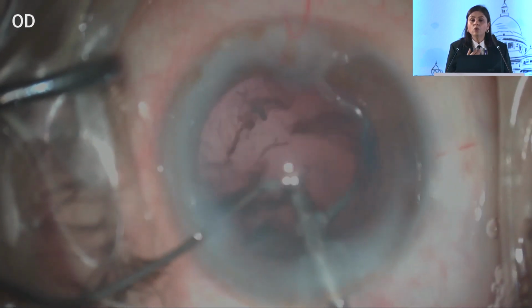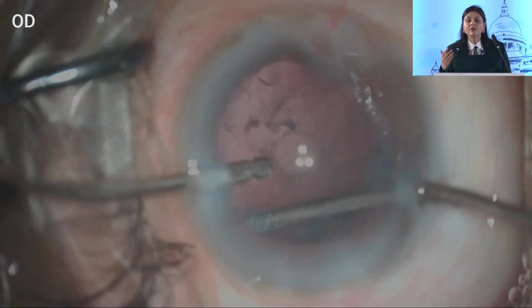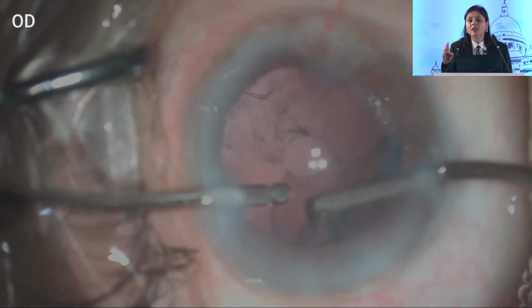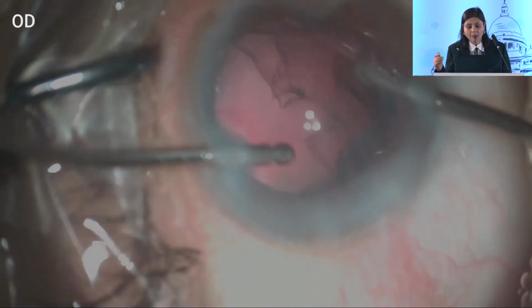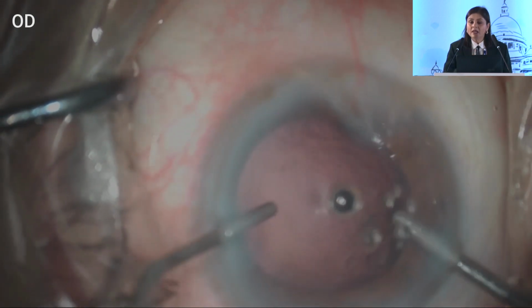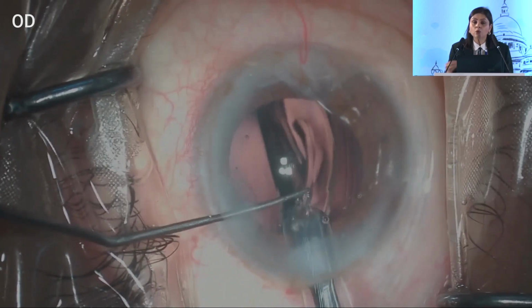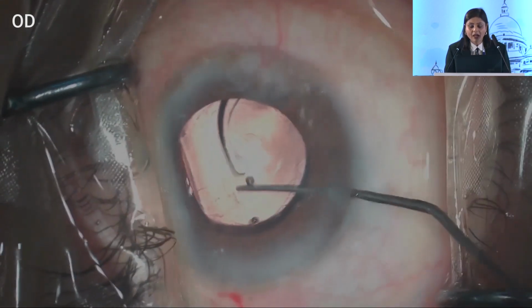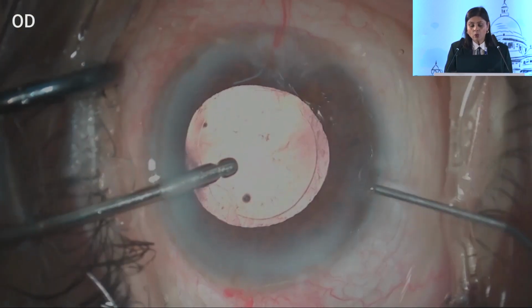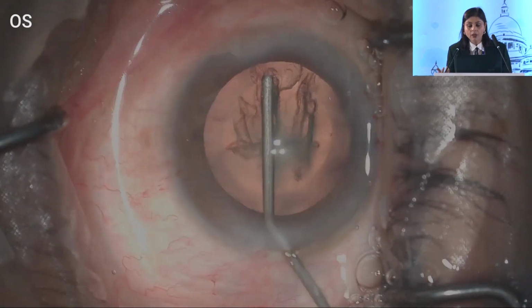This helps in removing the epinucleus because it prolapses it up a little bit, and also if we have had an inadvertent PCR, it kind of plugs that. Avoid too much over injection of OVD because that again can cause stress on the posterior capsule. If we have any fibers that are stuck on the posterior capsule, please resist the temptation to polish those, because just simple polishing in these patients can lead to a posterior capsular blowout, since these posterior capsules are extremely fragile. In the end, we place a single piece IOL in the bag, and even before coming out, I'm making sure that the chamber is stable and injecting an air bubble from the other side.